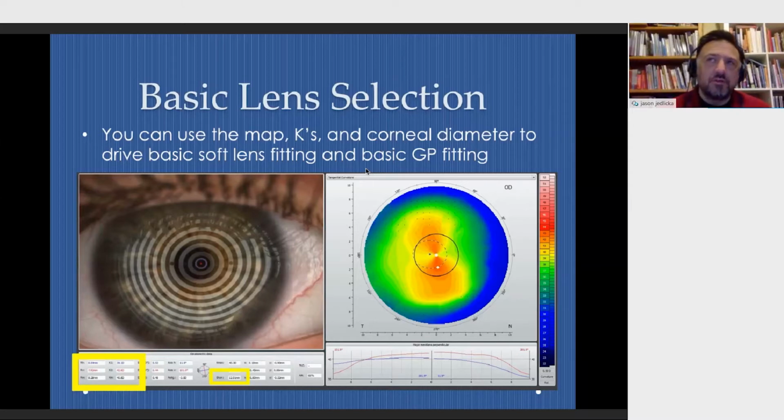As we move into the world of fitting lenses off sag information, or sagittal depth, sagittal height information with scleral lenses and some hybrids, we try to drive the point of sagittal height and sagittal depth home to our students, even for soft lens fitting.